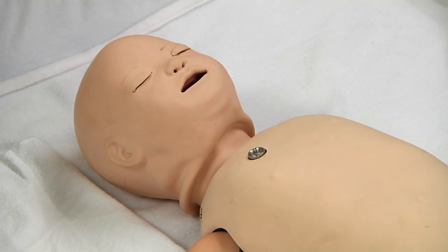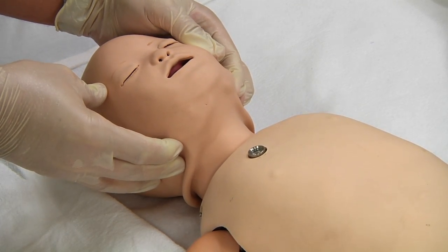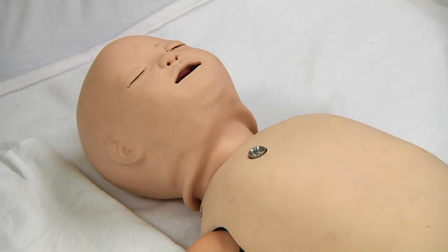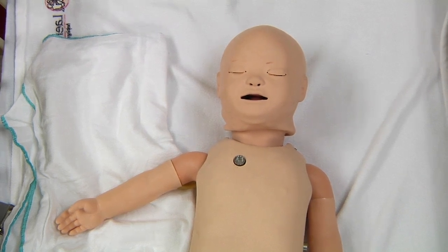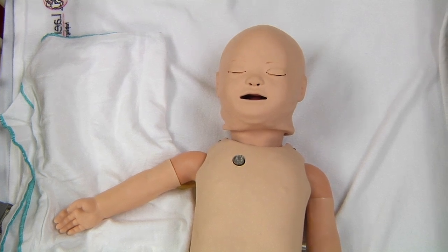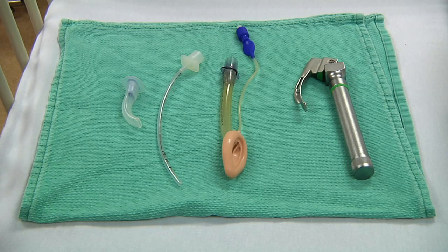Proper airway maneuvers, such as head tilt chin lift, should always be performed, as SimBaby is able to replicate several airway complications. As SimBaby has an anatomically correct airway down to the level of the bronchi, a number of airway adjuncts may also be inserted, such as an oral or nasal airway, an endotracheal tube, or laryngeal mask airway. The simulator will also allow for gastric tube insertion.